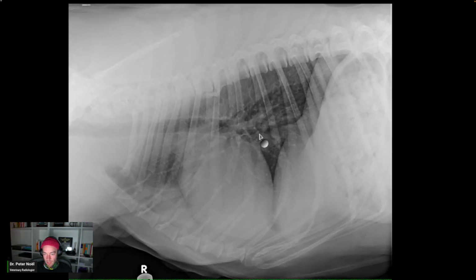This is fine. So sometimes you'll think that you have loss of waist, but the pulmonary veins, when they come into the left atrium, can give this sort of flamboyant caudal waist. And so it's actually accentuated, not lost. So no left-sided cardiomegaly. It's not too wide.